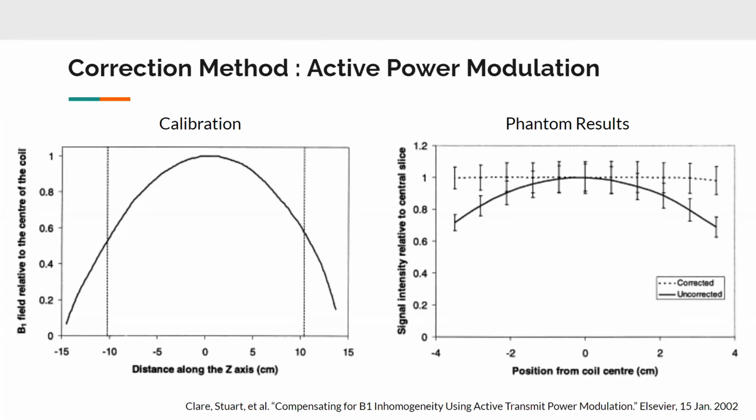And for a specific pulse sequence, how it worked was, like for any sequence, the values of each slice position were determined, and the appropriate RF transmitter power that scaled with it was read from a lookup table, so that while the sequence was run, a real-time slice counter could vary the attenuation of the RF transmit power.